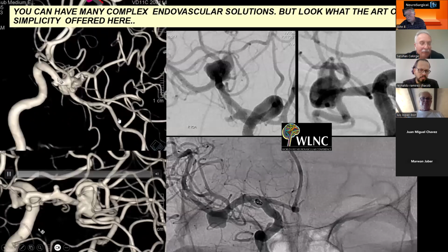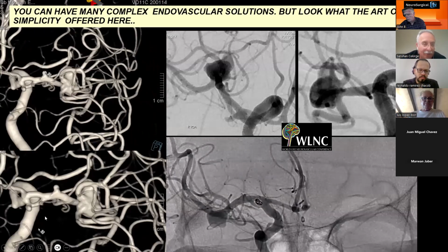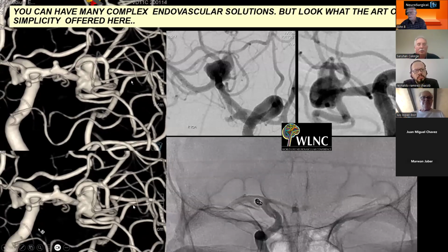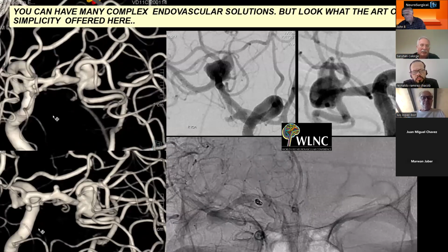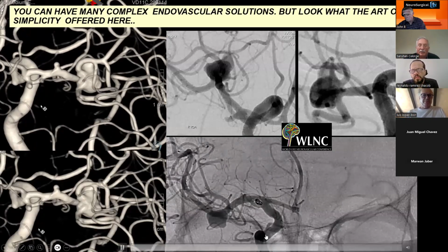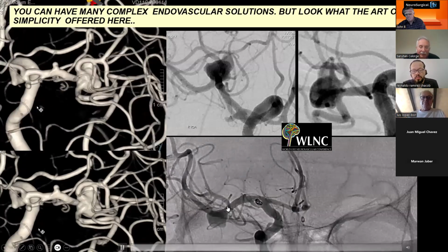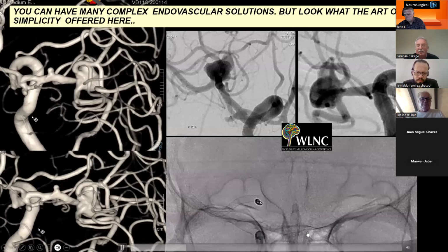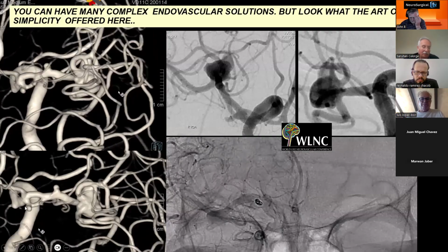M1 aneurysm, and proximal M1, there's a fenestration in the inferior arm, another aneurysm, and MCA bifurcation, another aneurysm. So in the live case show, I just opened this to discussion. There were many ideas, and some of them just told me, Professor Cekirge, how about if, as I learned from you, take a long pipeline and bypass the whole segment and put a stent here?